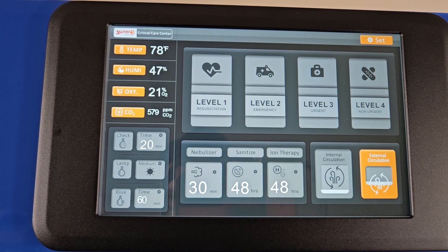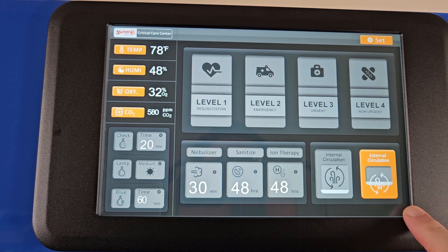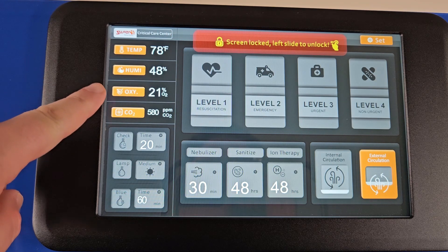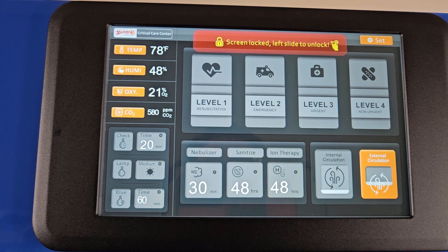You will want to ensure that the oxygen reading on the unit is calibrated correctly. To do this, set the unit to external circulation on the touch panel. Leave the front doors open for approximately one minute and then verify that the oxygen concentration shows at approximately 21%. If your unit does not show an appropriate oxygen reading, a calibration of the sensor will be needed. The oxygen sensor should be calibrated any time the unit is turned on, or if the cage is in heavy use, at least between each patient.